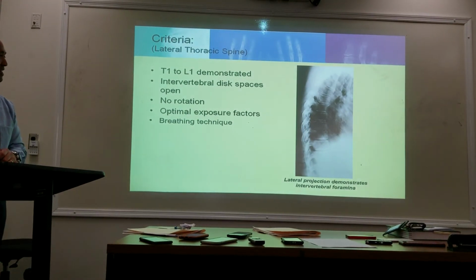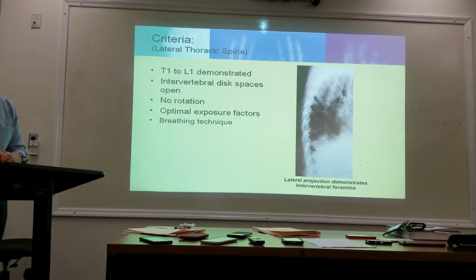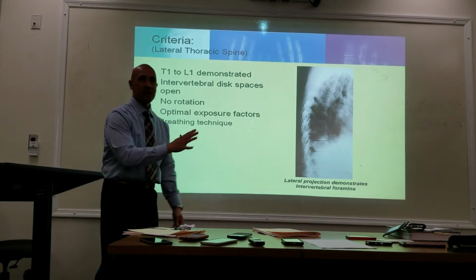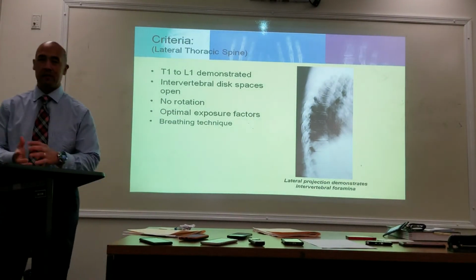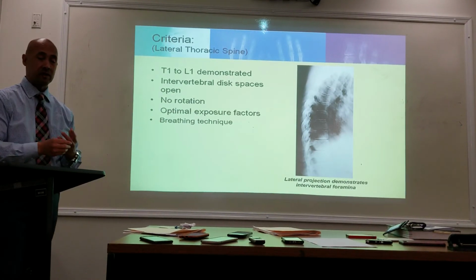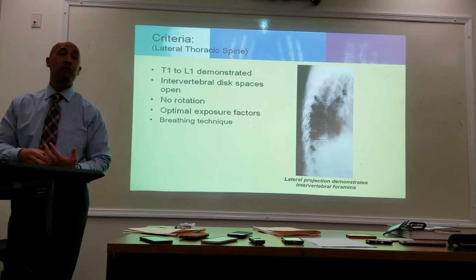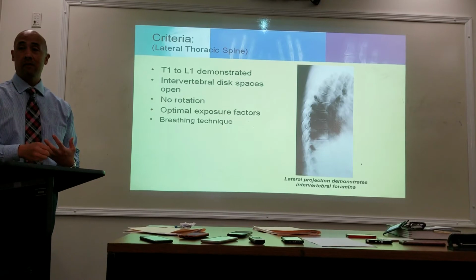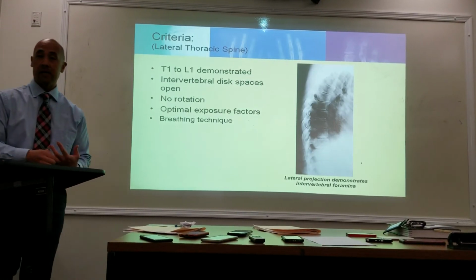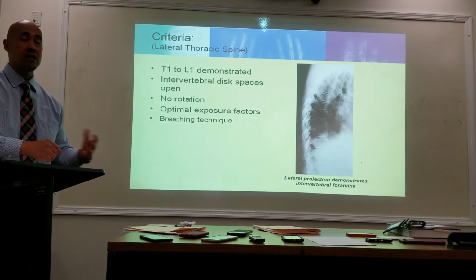All right, so lateral projection demonstrates the intervertebral foramina. Now, something a little bit different with lateral T-spines, and you're going to see a couple of variations. One, you will see your technologist having the patient hold their breath. But the proper way of doing it is through breathing. Again, 4, 5, 6 second breathing technique. So you have them breathe during the exposure.